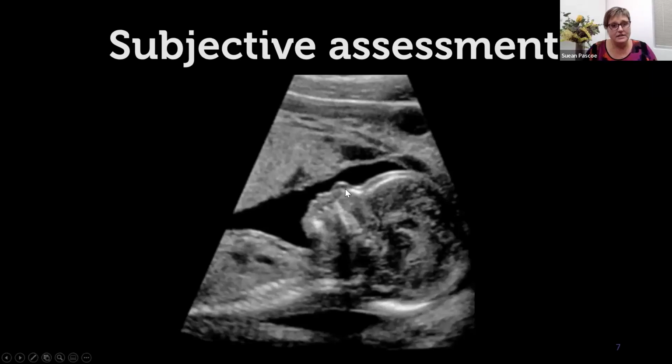And as we slide down to the baby's waist, can I see a puddle of fluid and see that the baby is surrounded by fluid with a good amount of space between it and the edge of the uterus? What we're looking to see is that there is enough fluid for the fetus to move freely and to delineate the anatomical structures. So if you're struggling to see anatomical structures, it's probably because there's not much fluid.